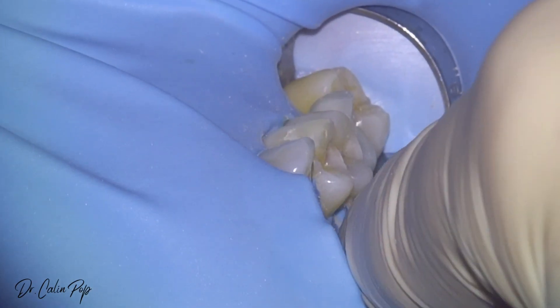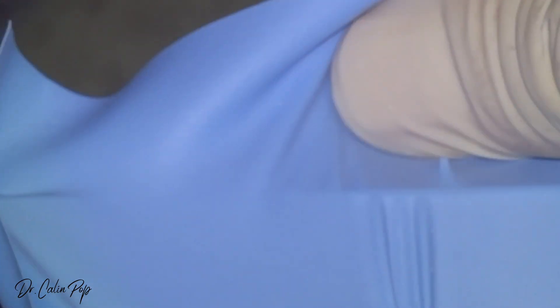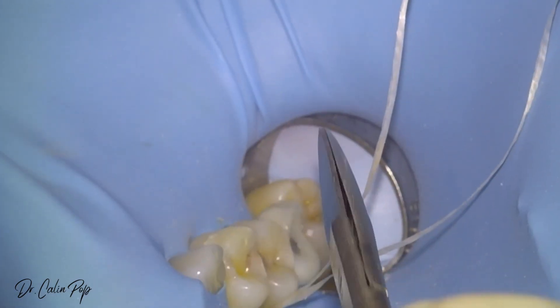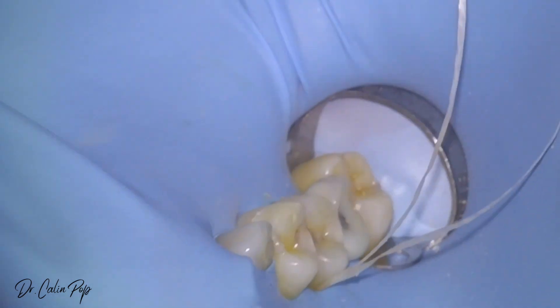Towards the palatal. The only purpose of attaching this part was to reduce the tension, which is actually good to do. Because sometimes when you are doing restorations on the last molar, if the tension is too much from here to the clamp, it is bringing the teeth towards the adjacent tooth.